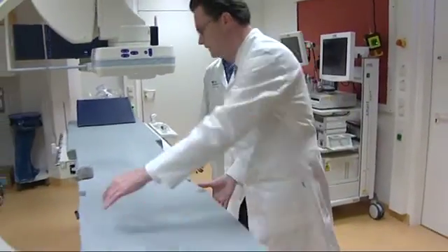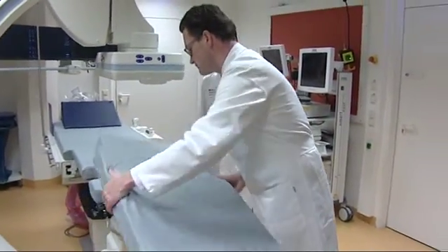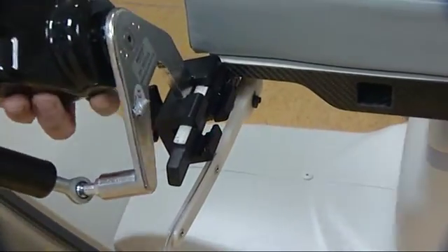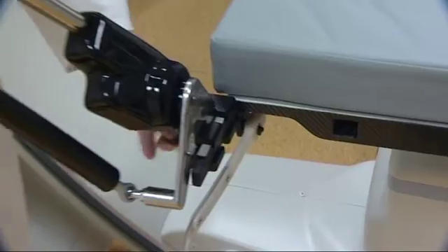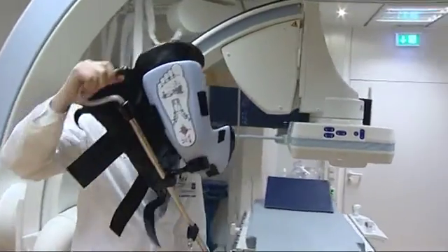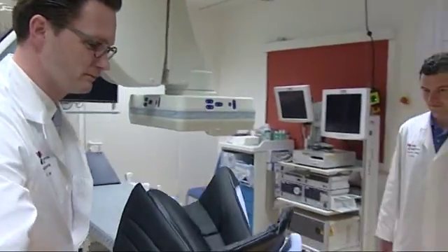Enclosed CTs, which are used first and foremost for diagnosis, do not offer access to the patient. For use during urological operations, the operating table had to be redesigned, since most operations here are carried out in the so-called lithotomy position with bent knees and straddled legs.